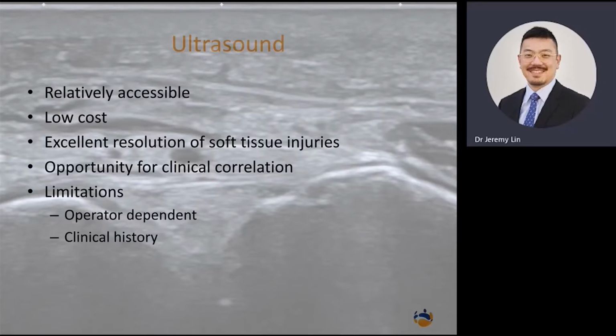It is also a great opportunity for us as clinicians to have the ability to interact with the patient. So I would often take the opportunity when they come in, if it's a particularly tricky case, to take a history, do an examination before doing a targeted ultrasound study of the region to look for any potential problems.